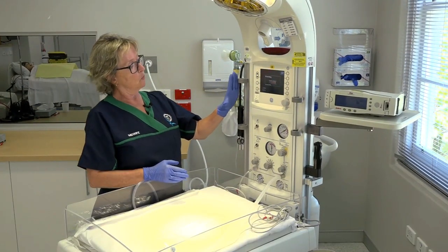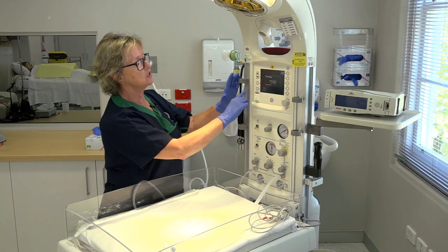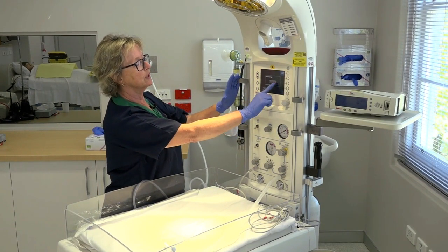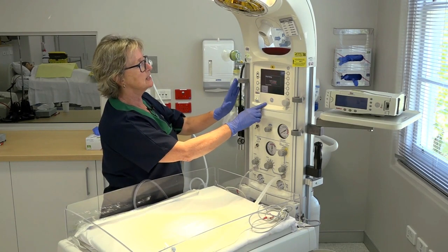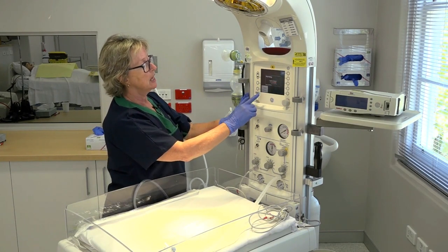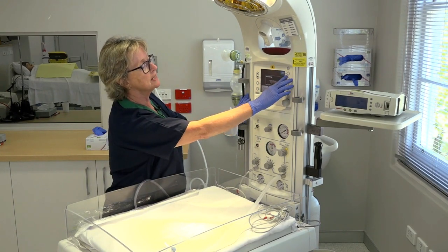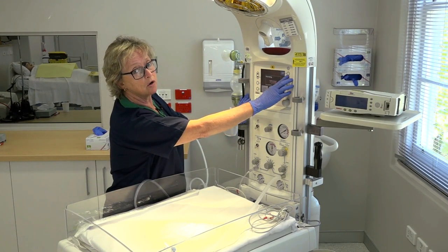Once the warmer has gone through its own checks, you'll see the initial screen that says 'warmer,' with the heater output going to 100% in warm-up mode. You'll see 'admit baby' flashing, and up in the right-hand corner we've got the Apgar on/off button.